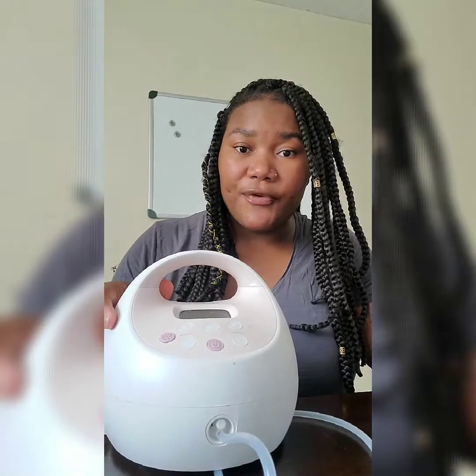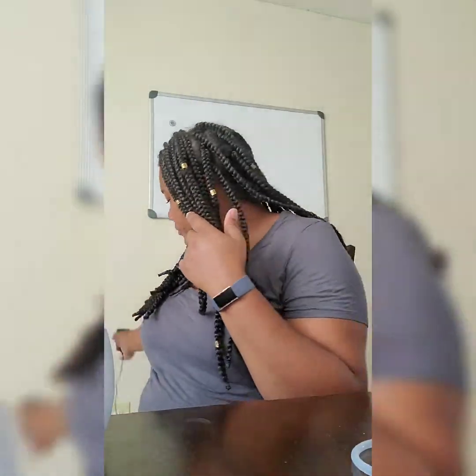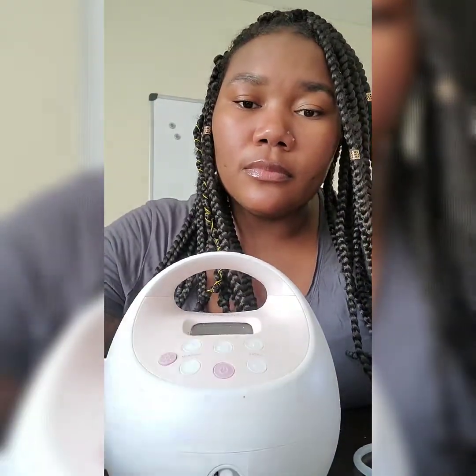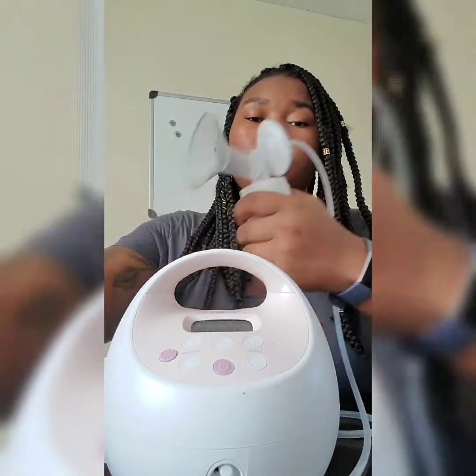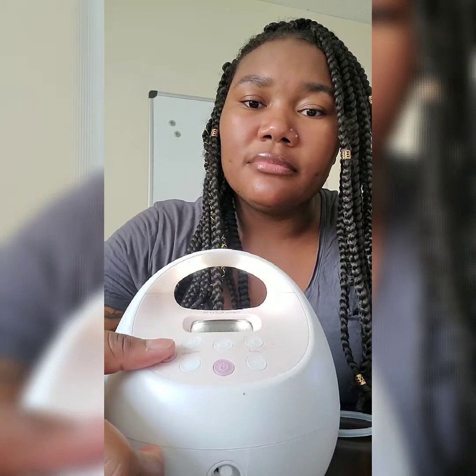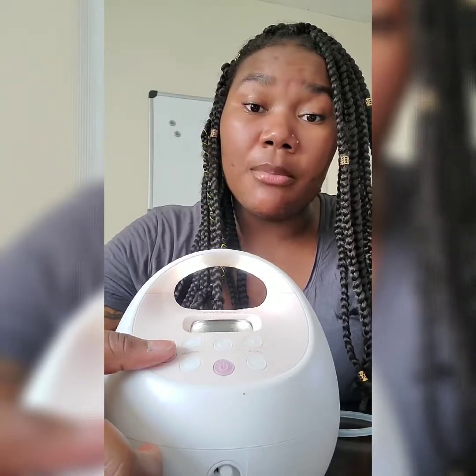The Spectra S2 comes in pink and blue. If you can't get it through insurance, I've seen it priced between $140 and $210 in retail stores. When I plug it in, this is what it sounds like — very quiet. It also comes with a light that can get brighter, so if you need to pump in the middle of the night without waking anyone up, it helps.